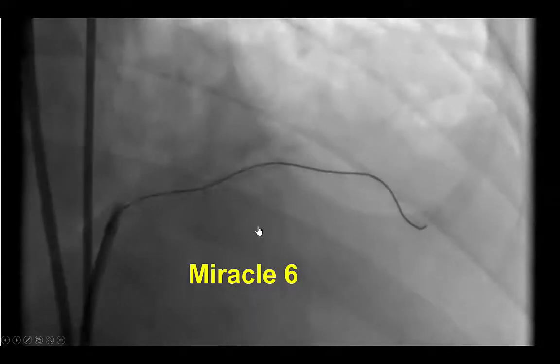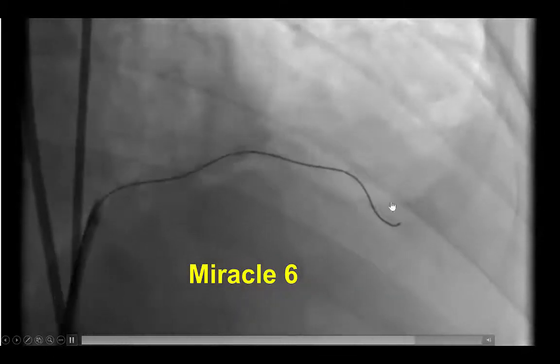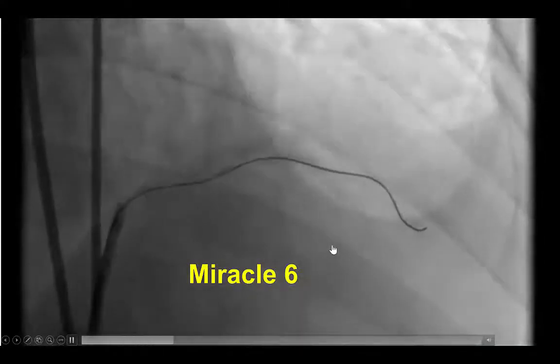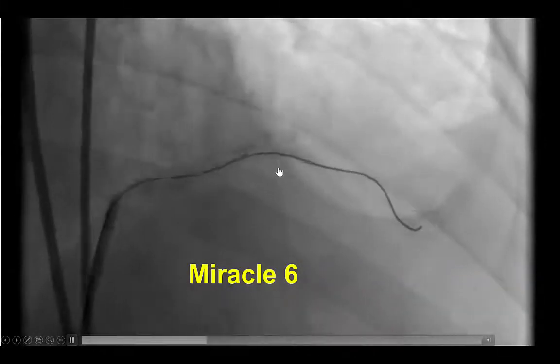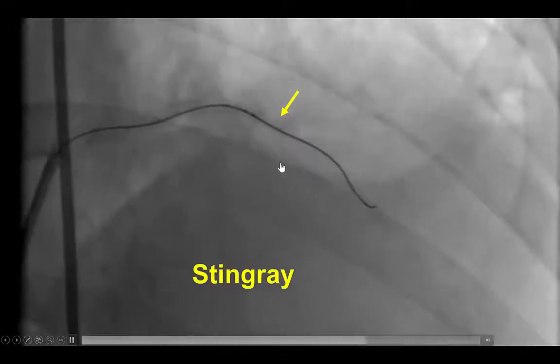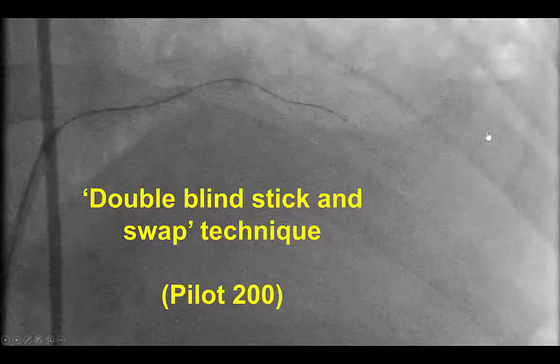We were then able to advance the guide wire to the distal vessel. We can see from the calcium in the vessel that there is movement of the wire in sync with the mid-LAD. We advanced a stiff Miracle 6 wire, which is very good for delivering the Stingray balloon, especially in cases with tortuosity and calcification. After significant difficulty and having to predilate the segment several times with small 1.2 and 1.5 mm balloons, we were able to advance the Stingray balloon next to the anticipated re-entry zone.